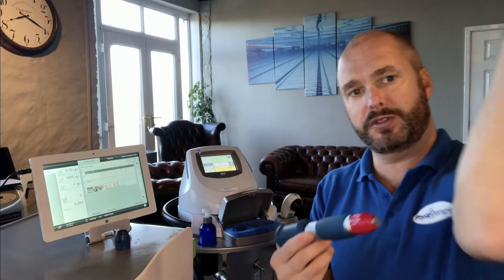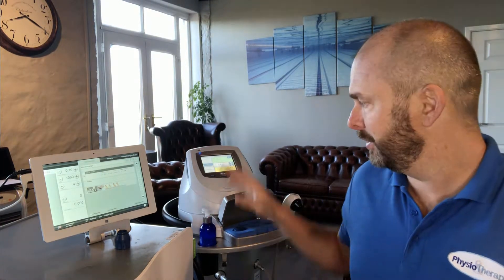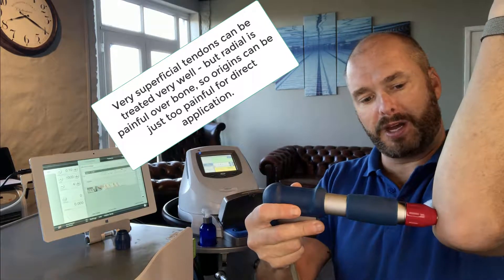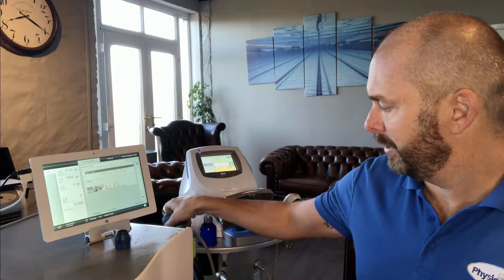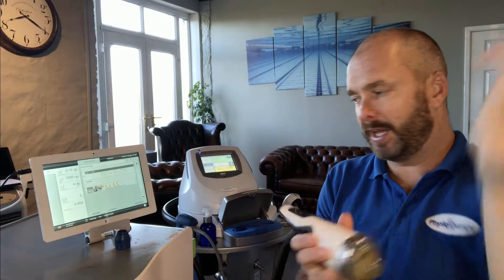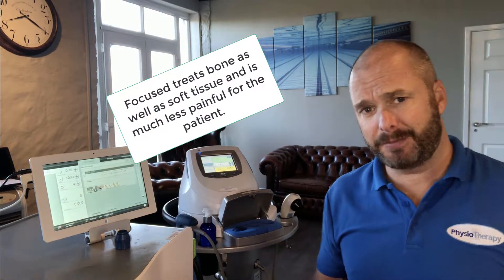For superficial tendons I think radial is brilliant, unless it gets too superficial. For golfer's elbow it's just too painful — you've got to bring the bar pressure down to a very low level, and you can't work directly on the bone, you have to work about half an inch away as the waves fan out. With the focused machine you can go directly onto the common origin and the patient will be able to accept it.